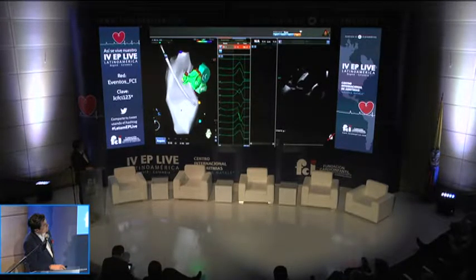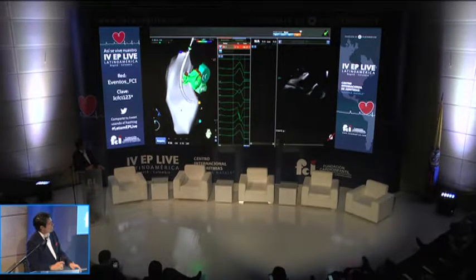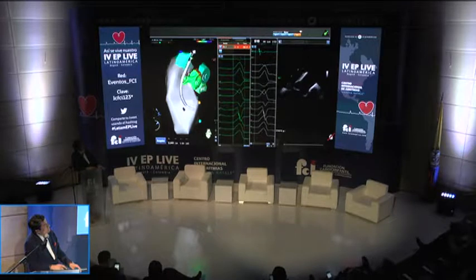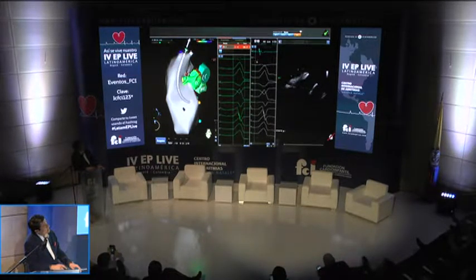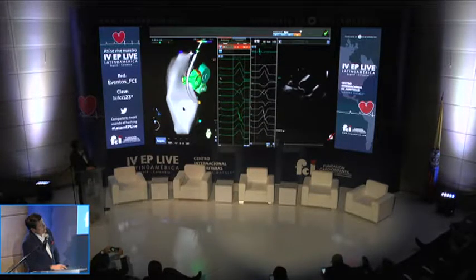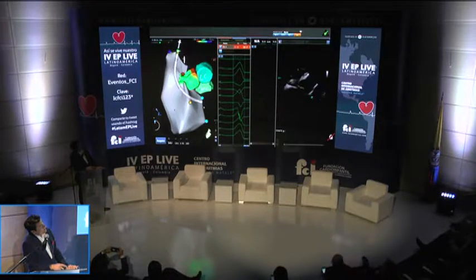Then we went to the left side, and that is what you saw, the right coronary cusp really having a pass of 87%, which is a good pace map. But what we've seen with the pace maps is that ideally you should almost be above 97%, because with 87 at this point, I wouldn't apply. I think that we still need more mapping, and having more extrasystoles in the patient, we are going to start mapping the right side now.